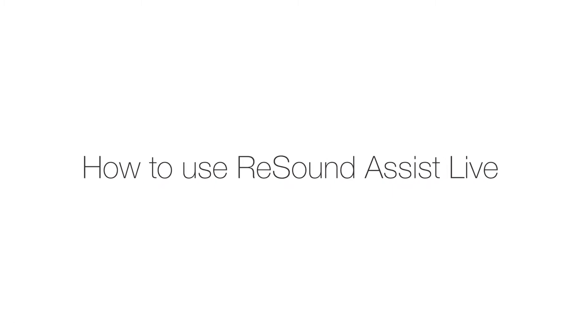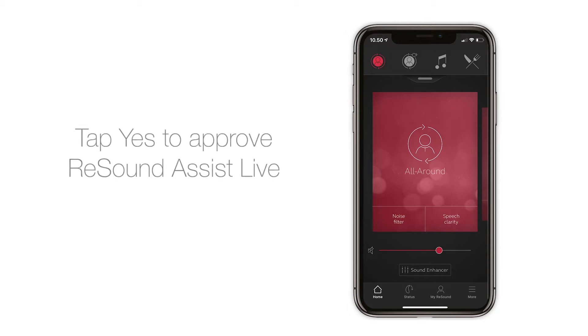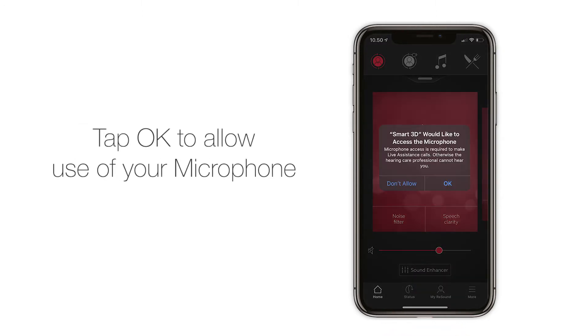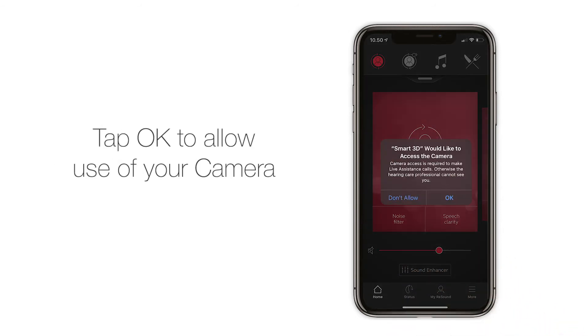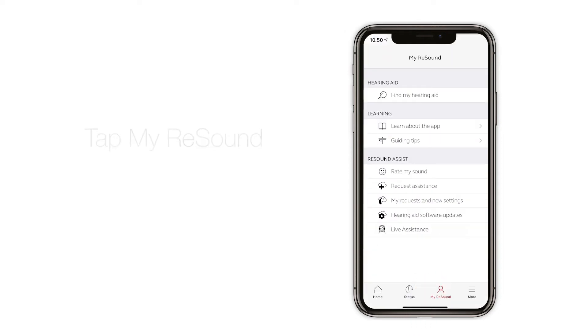How to use ReSound Assist Live. Before you use ReSound Assist Live, you need to set up a few things. Start by opening the ReSound Smart 3D app. The app will need to use your microphone and camera — tap yes to start approval, tap ok to allow use of your microphone and your camera. Go to My ReSound and tap on Live Assistance.